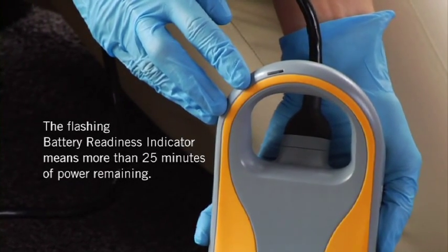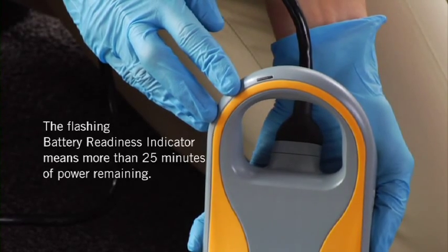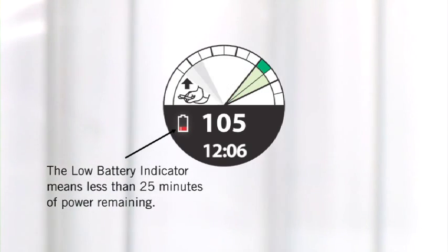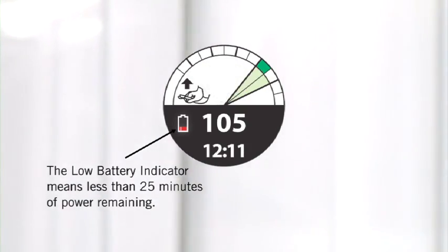That means TrueCPR has enough battery power to operate for at least 25 minutes. If the light is not flashing, replace the batteries immediately. If the low battery indicator appears during use, TrueCPR has less than 25 minutes of power remaining — replace the batteries as soon as possible.